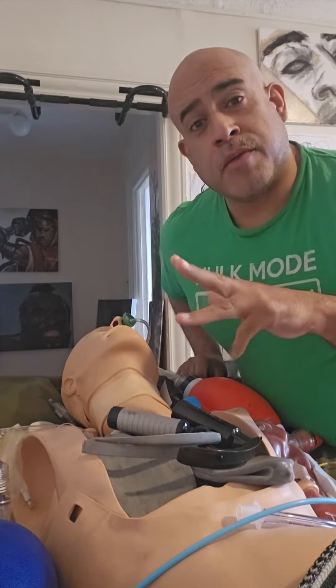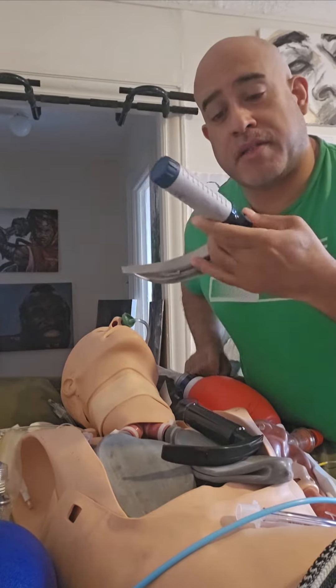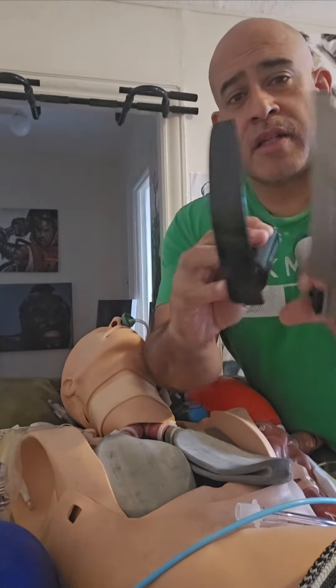Hello, I've come to talk about an issue about blades. Today's issue is about blades. This is a size 4 blade, Macintosh. This is a size 3 blade.